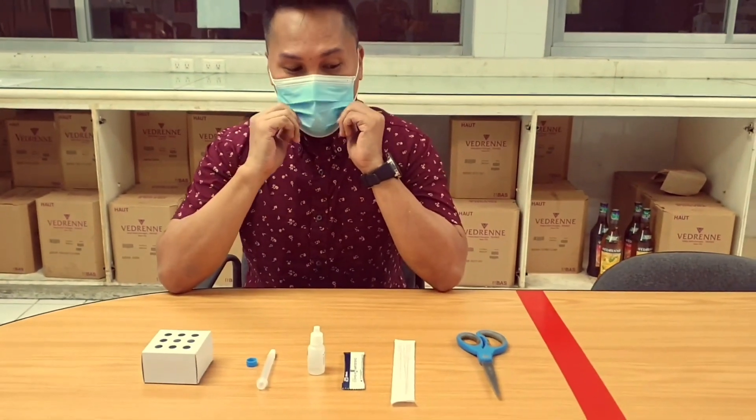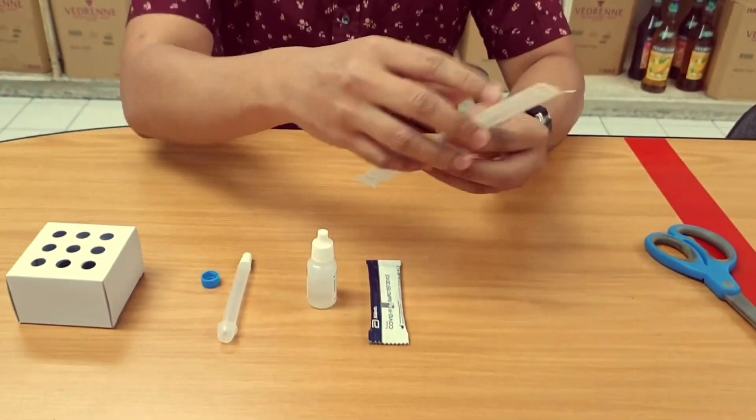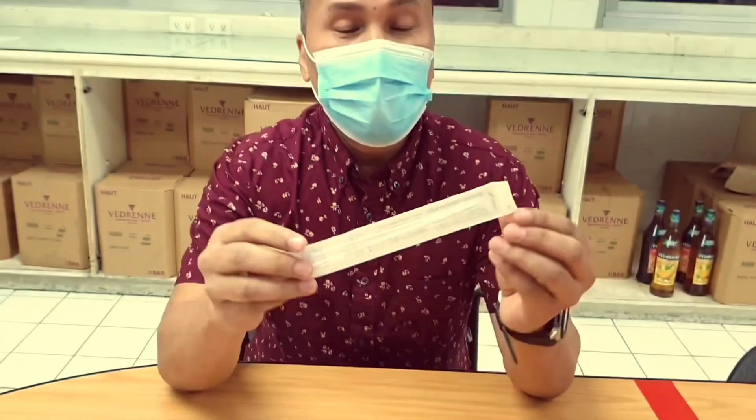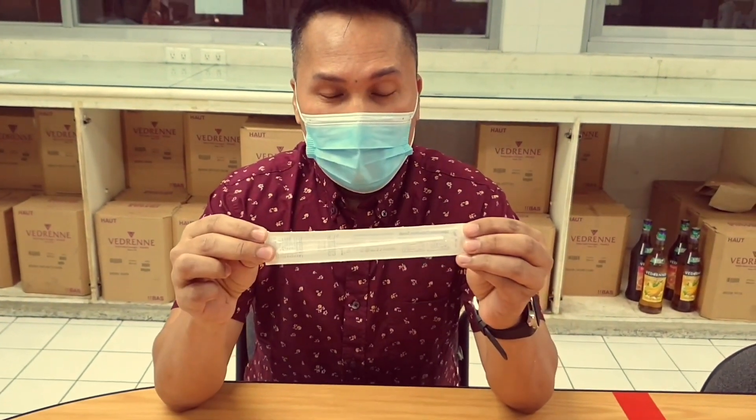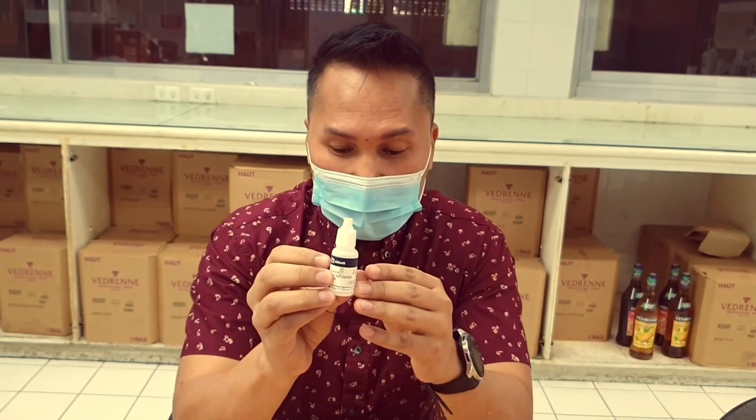To start, these are the things that we need. First, we have the specimen collection swab, which is used to swab the patient's nose — it is inserted into the nose to collect a specimen. We also have the COVID-19 rapid test device, the rapid test device buffer, the collection tube, and the tube rack.